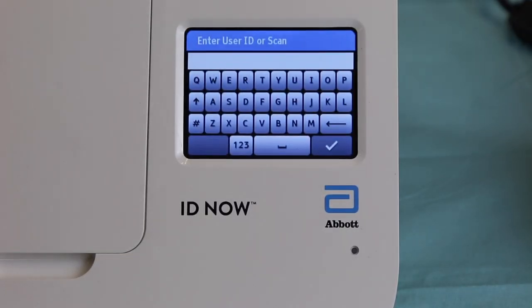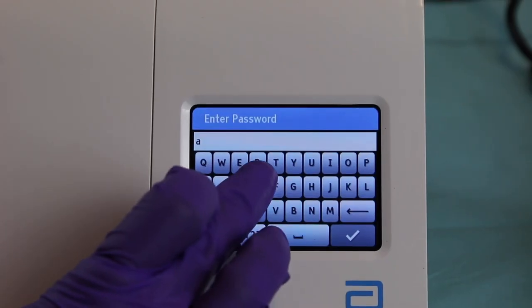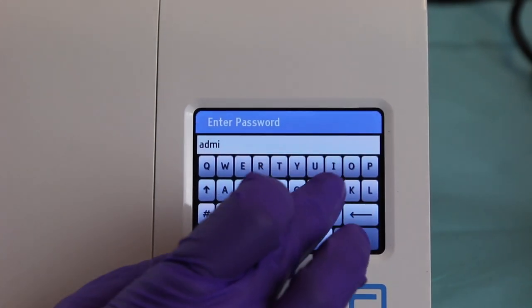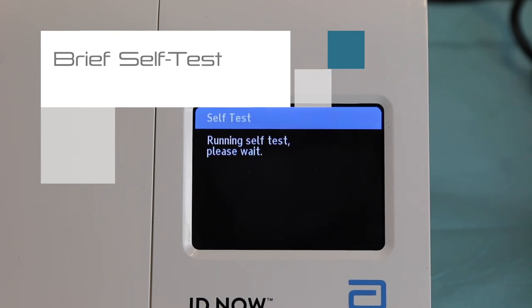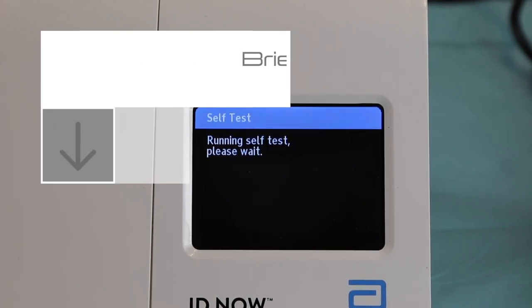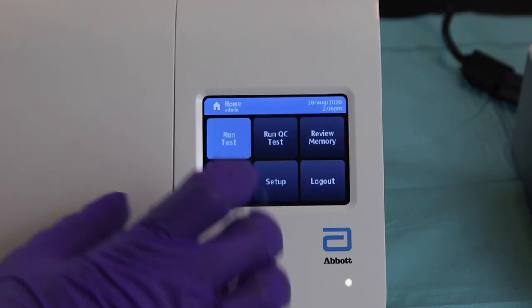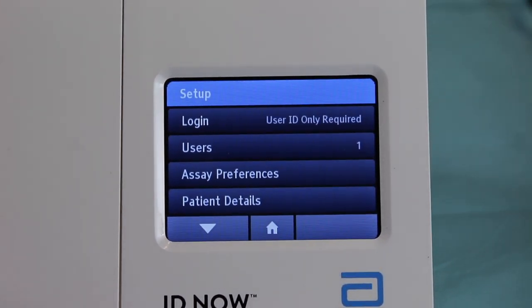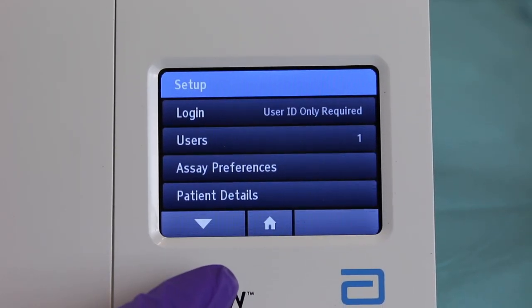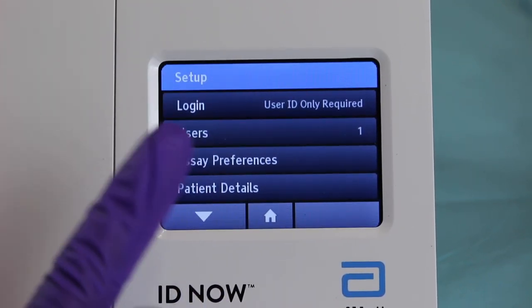Once the IDNOW initializes, it will ask for a username and password. Both the username and password are 'admin'. If the machine is brand new, you will need to access Setup in the home menu. Setup will allow you to use the machine — it will give you the users, which is just one user, the admin.